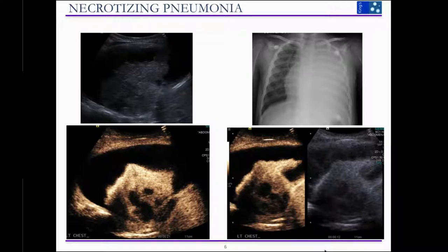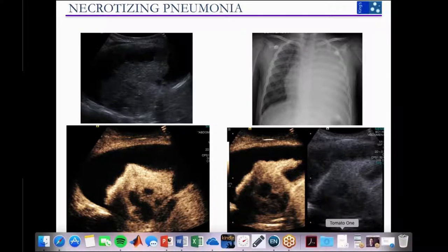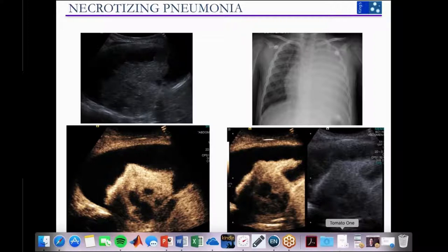Here is another example — a child where the chest X-ray shows opacification throughout the left lung with the mediastinum shifted slightly to the right. Is this all pleural fluid, all empyema, or what's going on in the underlying lung? Following IV contrast administration, you have very beautifully outlined necrotic collapsed lung and surrounding pleural empyema, which on grayscale imaging is difficult to differentiate as fluid. This aided the clinicians in placing a drain, and the child was sent home sooner following drainage of the empyema and IV antibiotics.